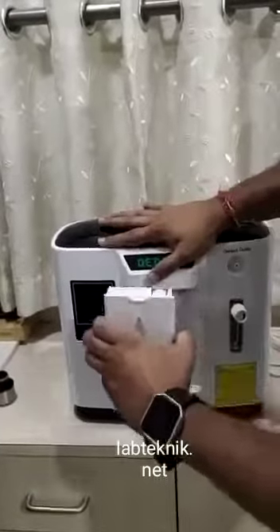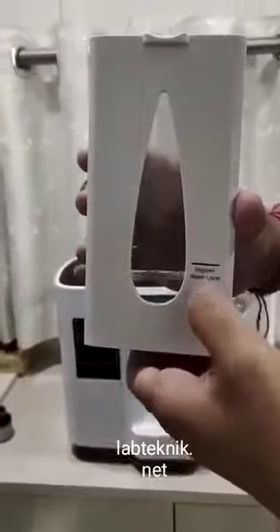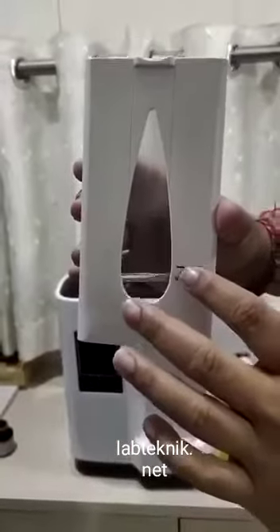First thing you need to do is fill this tank with water. The water level should not go above this line.